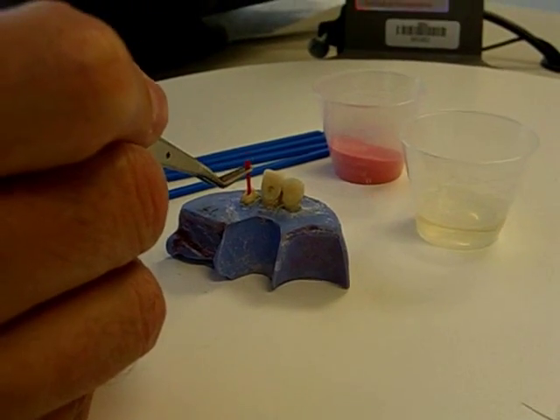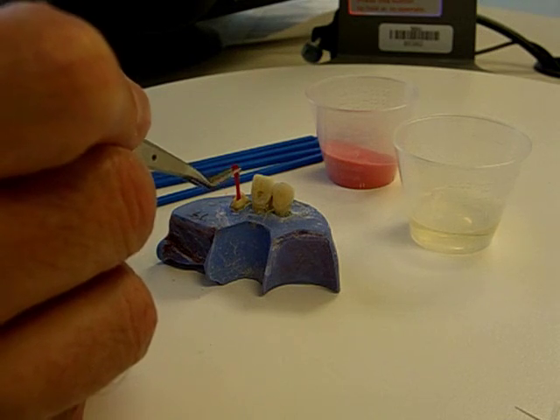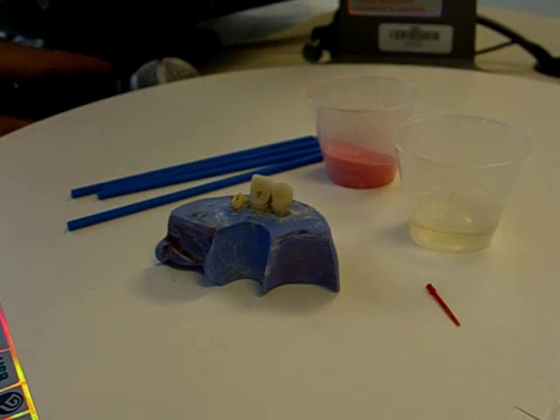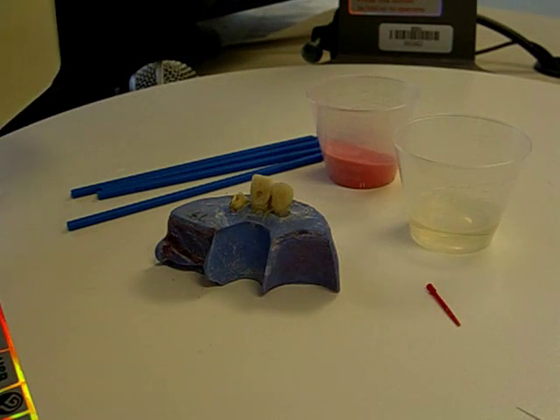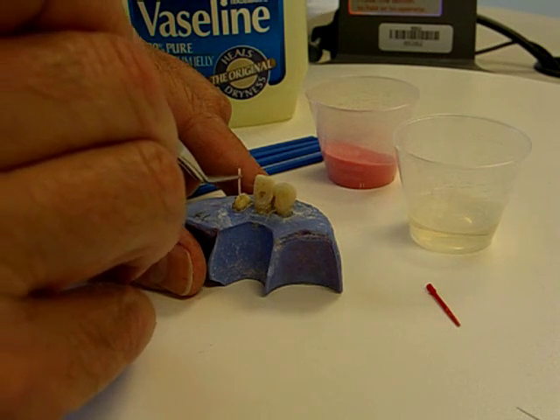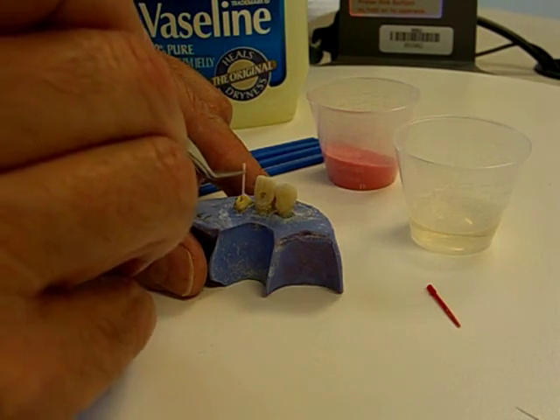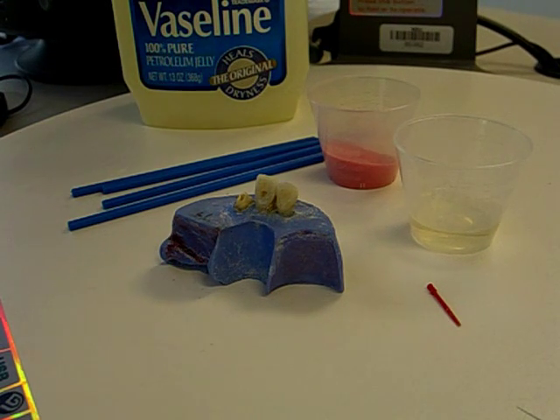This sprue fits extremely passively in this canal — there is absolutely no resistance whatsoever. So at this point, I'm going to remove the sprue and vaseline that canal lightly. I have made every attempt to distribute the vaseline equally along the dental walls of the canal space.